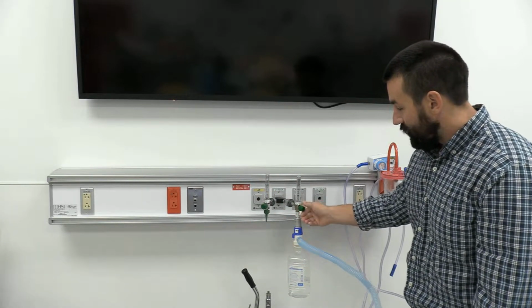If you did your air entrainment ratio, okay, 100 minus 30 is 70. All right, we have 30 minus 20 is 10, so you got 70 to 10. Divide each of those by 10, okay, and you end up with 7 to 1, so 8 parts. We need 60 liters of flow ideally, so if you divide 60 by 8, you end up with what, 7.5. We're just going to round up and run a 30% at about 8 liters a minute. All right, input flow, and that should get us close.